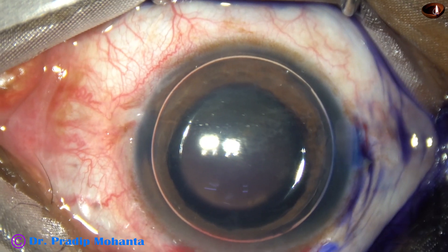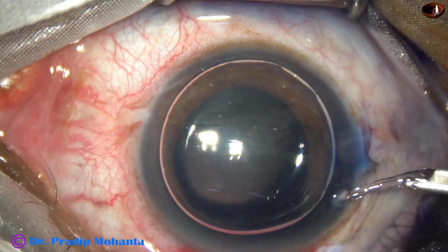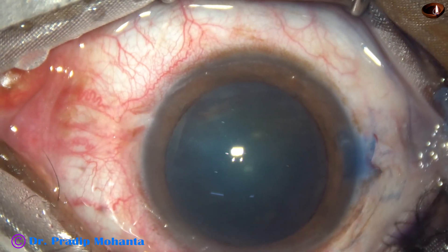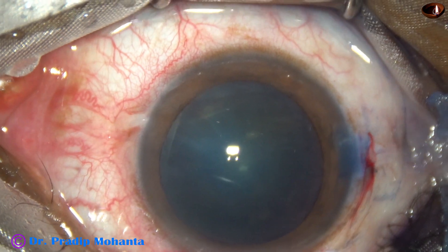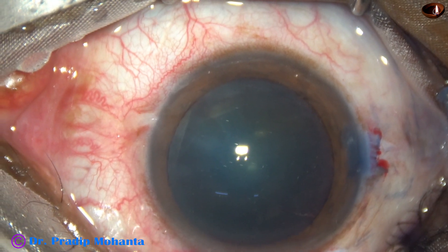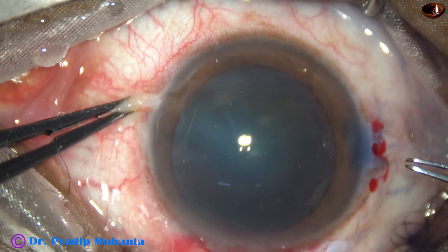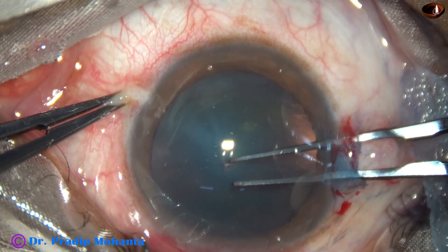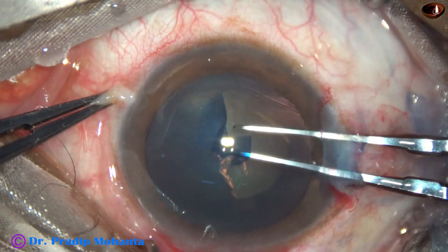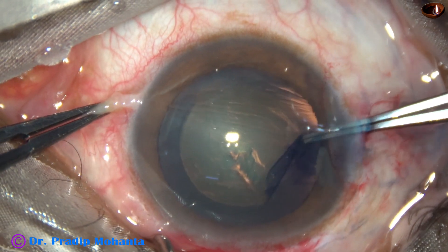Trypan blue dye is applied over the anterior capsule. This is a bit of adrenaline. The dye is washed out. Then 2 percent hydroxypropyl methyl cellulose is used to fill the anterior chamber. Now I am going to use Utrata forceps for the rhexis. The size of this rhexis is about 5.5 to 5.75 millimeters, less than 6 millimeters.